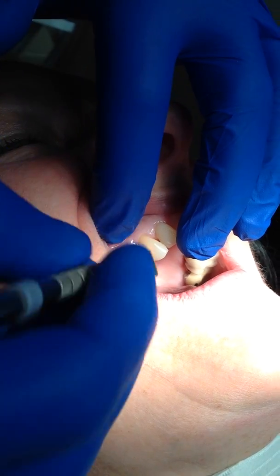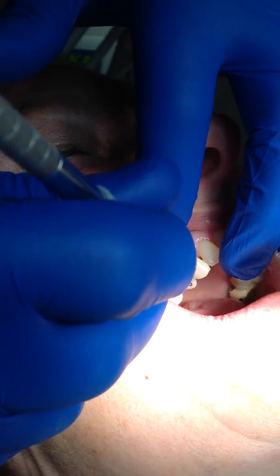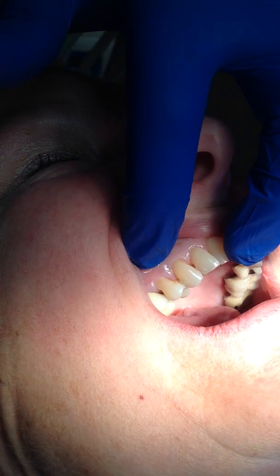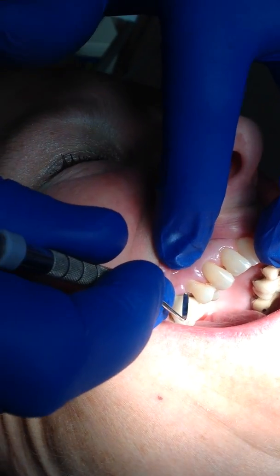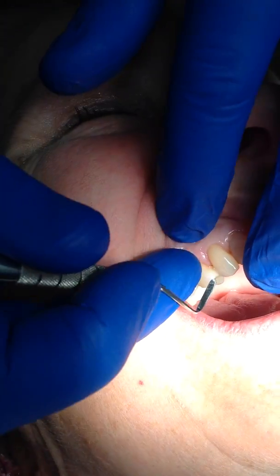I'll go ahead and cure that. And I think that's going to be a rather nice looking color. So that's going to be the color we're going to use.